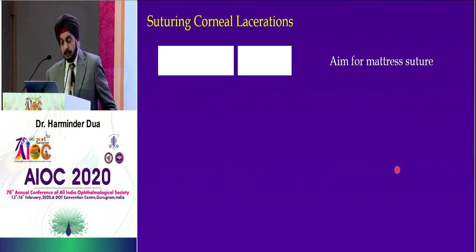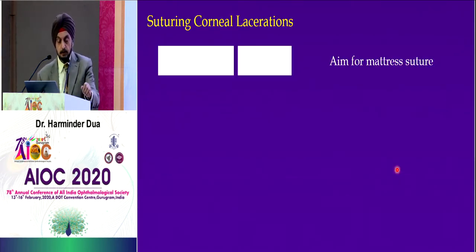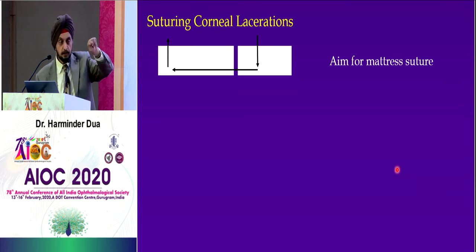Now, looking at the depth of the wound, how far will you go? So if you go like that, 80% of the depth, then along and like that. Now, it's very difficult to get right angles in the passage of your needle because it's a curved needle, but you go vertically straight down, turn it around, move along, and don't start directing it towards the surface right as you start. Move it along flat and then turn it up, and you will get this mattress effect.